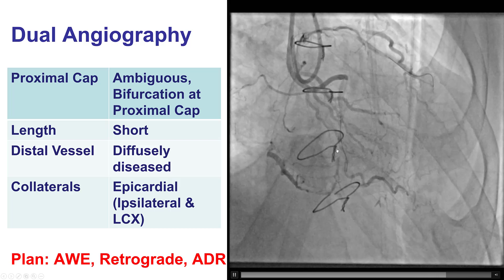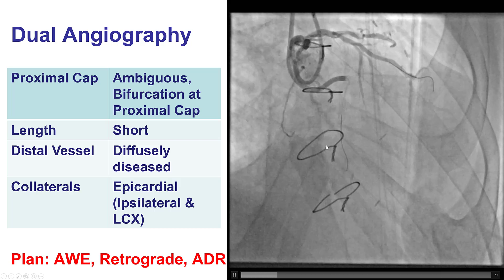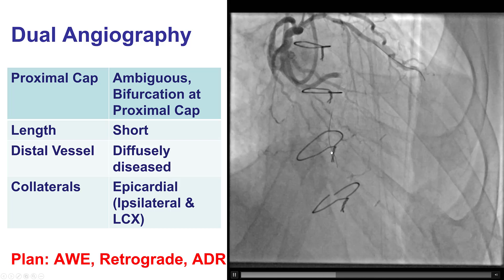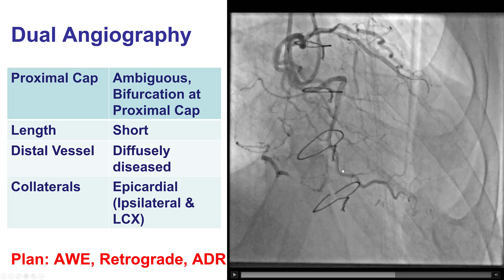We do have an RCA CTO in the mid-right coronary artery with a blunt proximal cap right at the takeoff of an acute marginal branch. The length of the occlusion was short, the distal vessel was diffusely diseased, and the vessel was filling via epicardial collaterals from the left. There were also some ipsilateral epicardial collaterals.